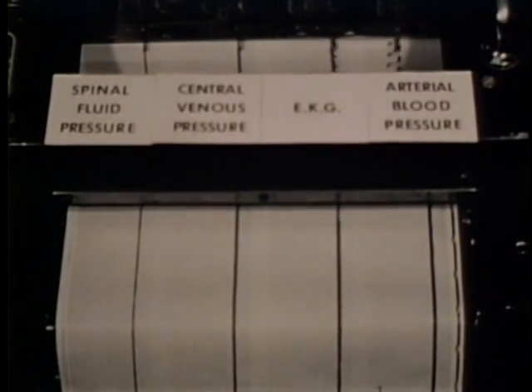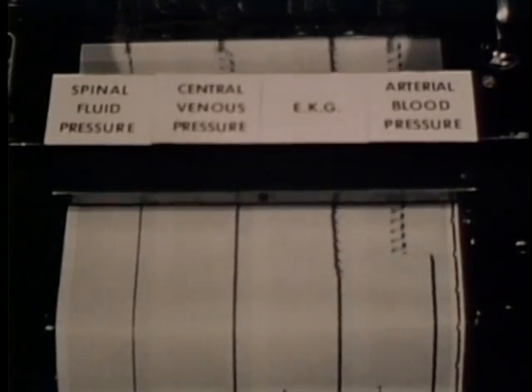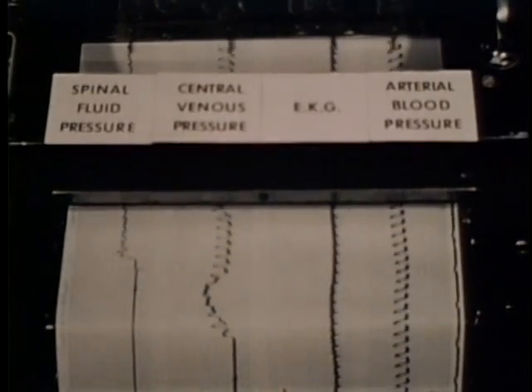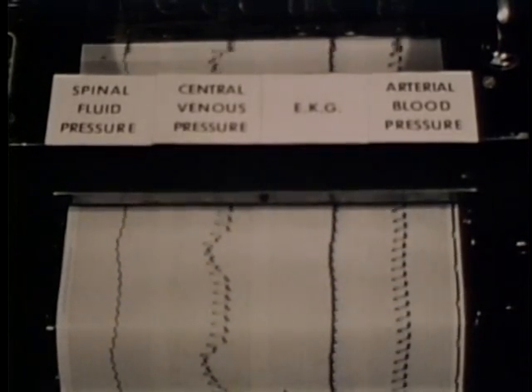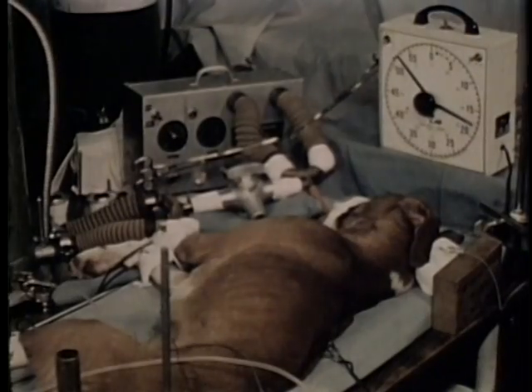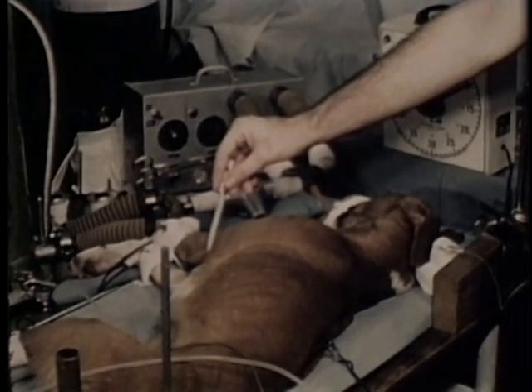On this control record, the baselines indicate the point of zero pressure. From right to left are recorded mean arterial blood pressure, electrocardiogram, central venous pressure with typical respiratory waves, and cerebrospinal fluid pressure. On the record taken immediately after the onset of apnea, the influence of thoracic movements is no longer visible. 7 minutes after stopping the ventilator, there are no respiratory efforts or movements on the part of the dog.